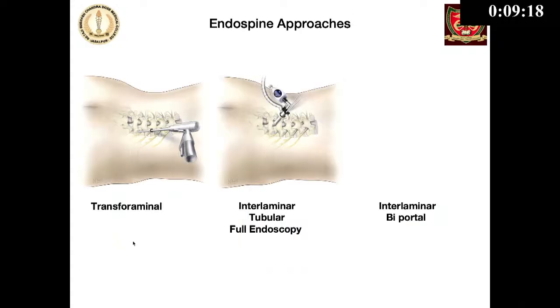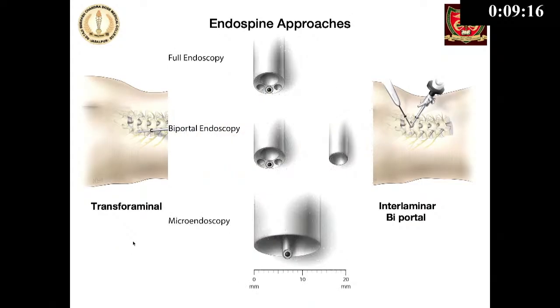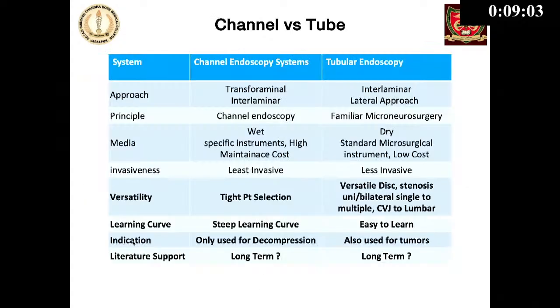So many nomenclatures have been given. I think Rahul sir has already discussed them. So these are basically the two types of approaches, and I'm going to discuss these interlaminar tubular endoscopic approaches.